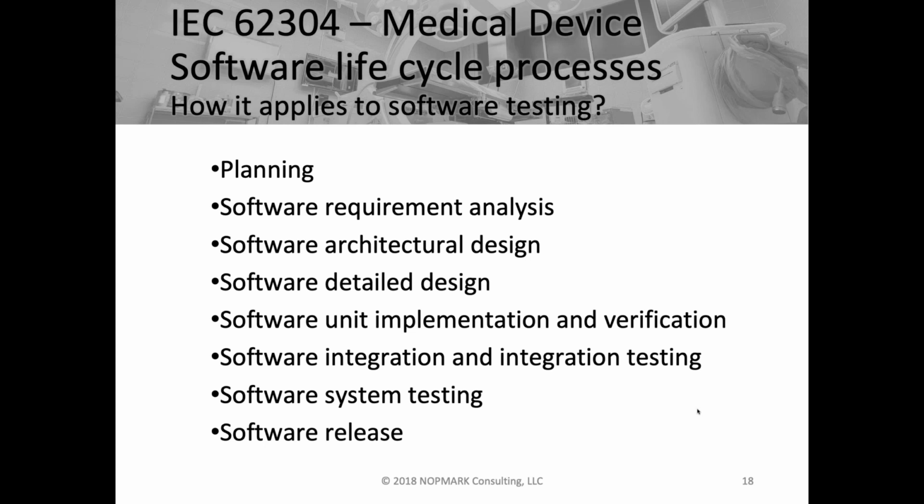So part of what is being asked is not only that you have software requirements, but you actually go through an analysis of the requirements. Are your requirements complete? Are they conflicting with other requirements? Are they testable? You've heard some of these things in other training you've gone to or within your own company, but how you review requirements. So this standard is asking for that analysis.